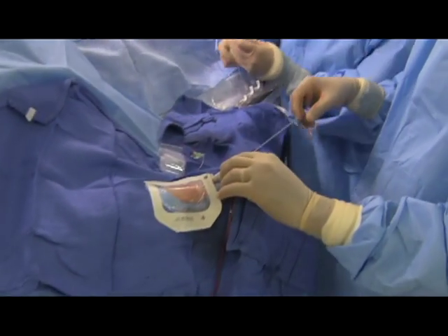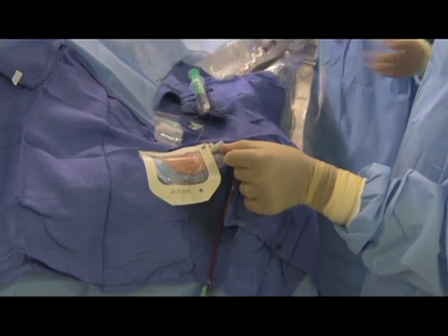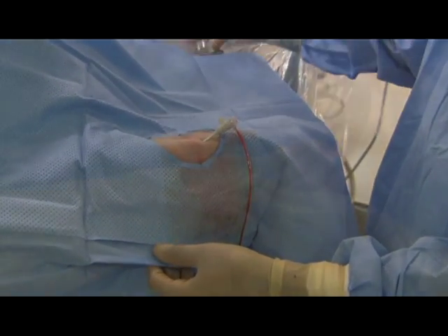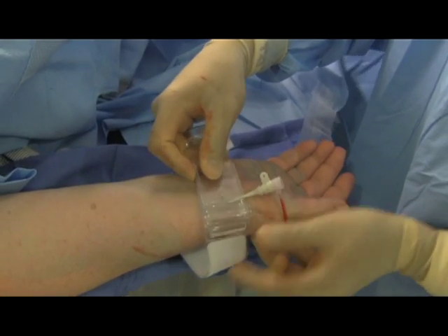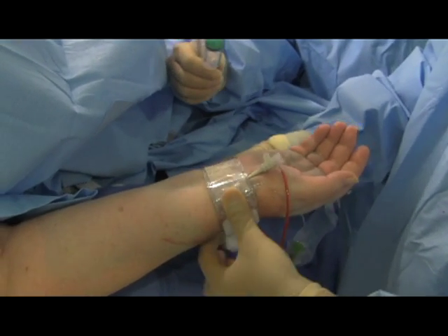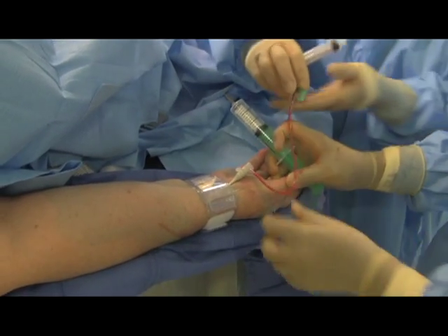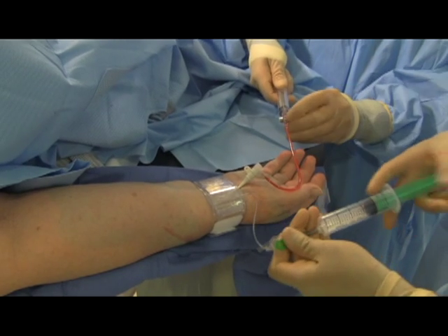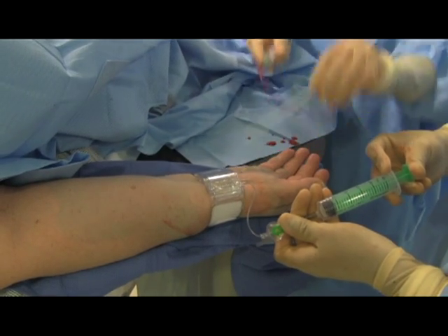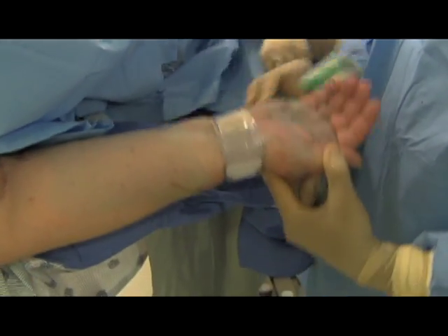The heart catheterization is finished. We will now be removing the catheter from the sheath. We are now preparing the patient's wrist for TR band placement. Dr. Patel is placing the TR band on the patient's wrist. The dot is above the puncture site. Dr. Patel will inflate air while simultaneously removing the arterial sheath. The arterial sheath is removed. The TR band will remain in place for approximately 40 minutes and be removed in the pre-op area.